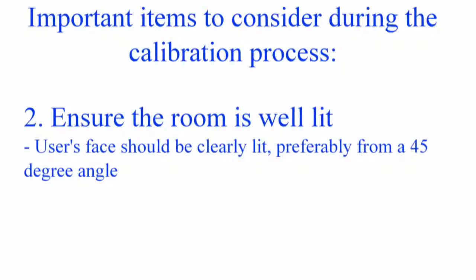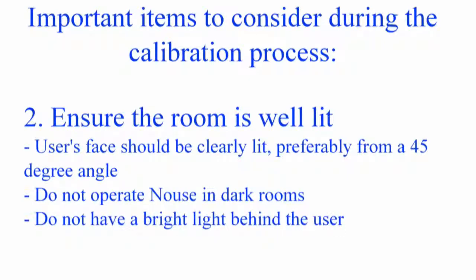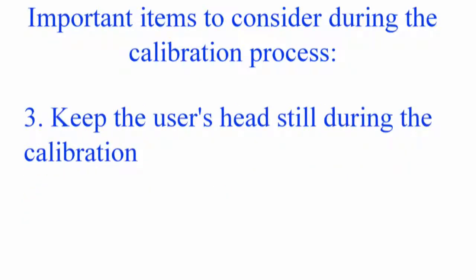Do not operate Nouse in dark rooms and do not have a bright light such as a window behind the user, as this will create shadows on their face. And third, keep the user's head still during the calibration.